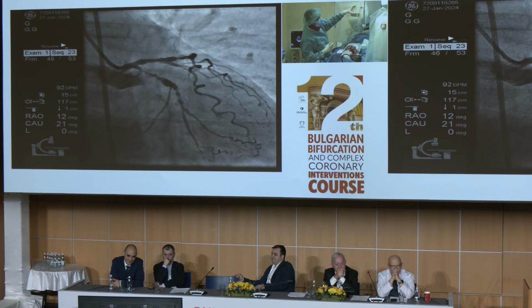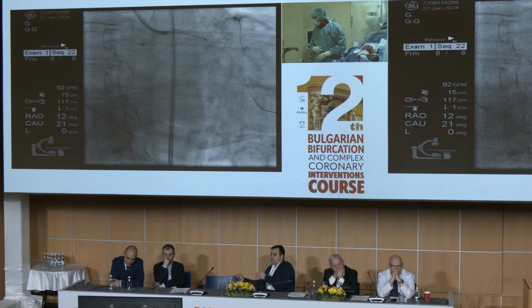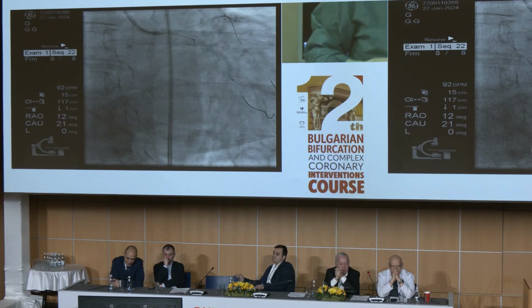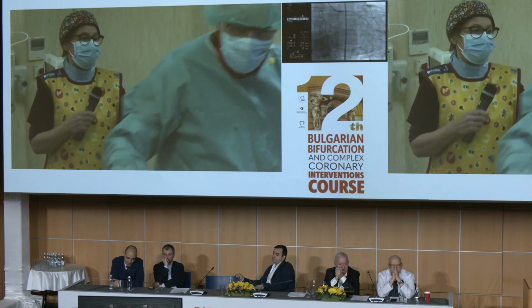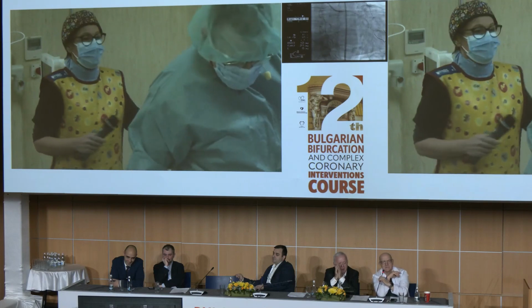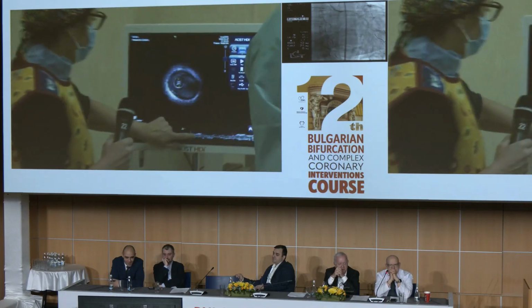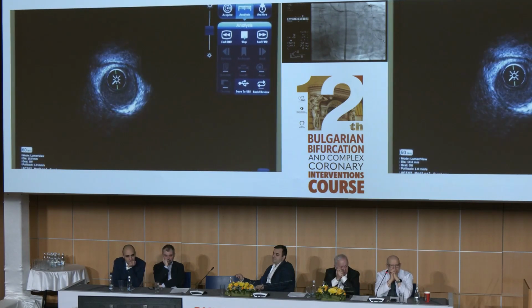Oops. Just to keep the suspense. So we are... This is the IVUS from the LAD, distal to proximal. You see? No. Dobry is just in front of the camera. Sorry. Okay, so we're going to start again.